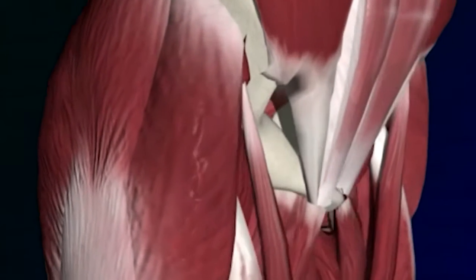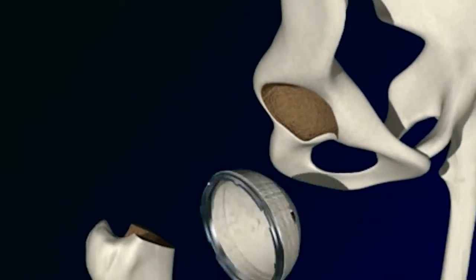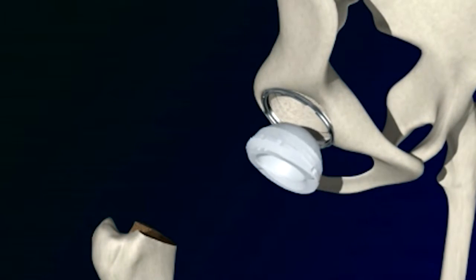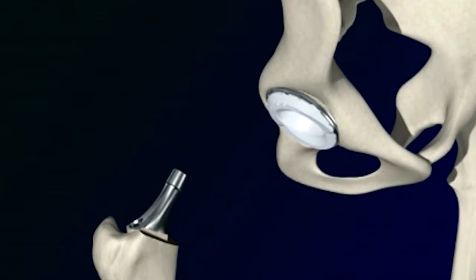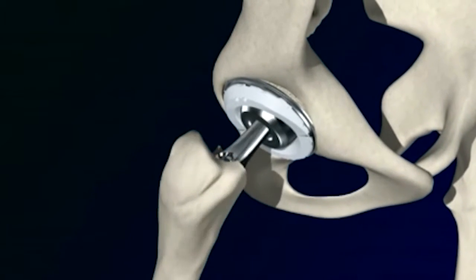Hip replacement surgery involves replacing the natural joint with an artificial joint. That includes replacing the hip socket with a new socket and replacing the hip ball with a new ball. There are various ways of doing that through different approaches to the hip, including anterior approach, lateral approach, and posterior approach. It would depend on your body anatomy, your size, and various other aspects that you should discuss with your doctor when planning this surgery.